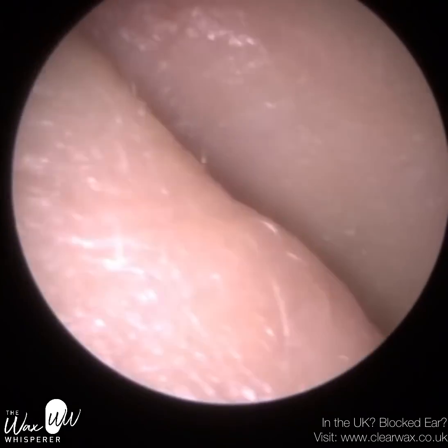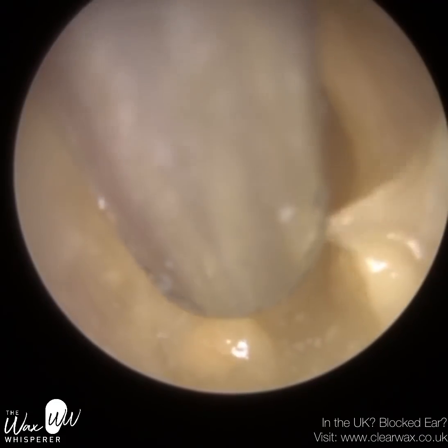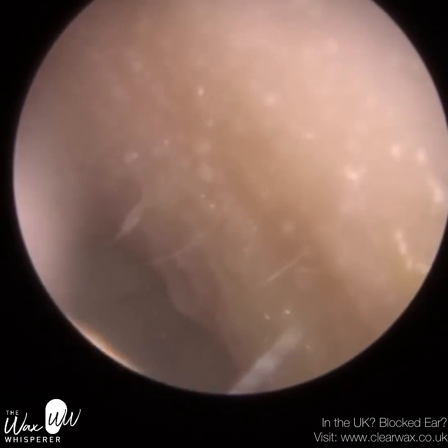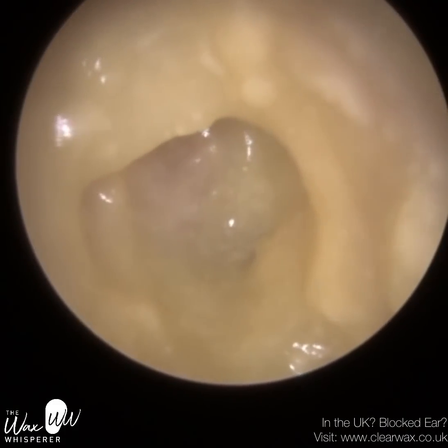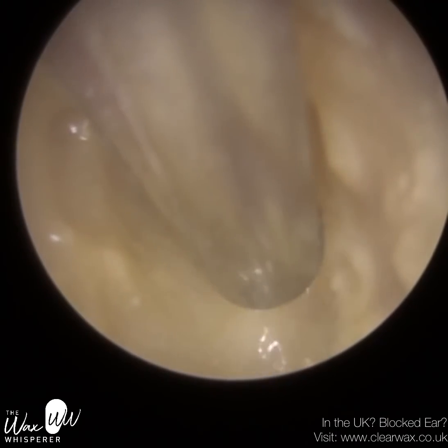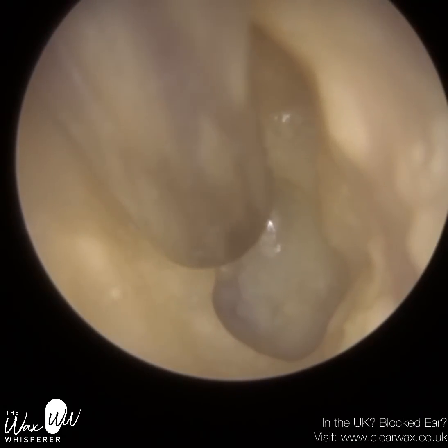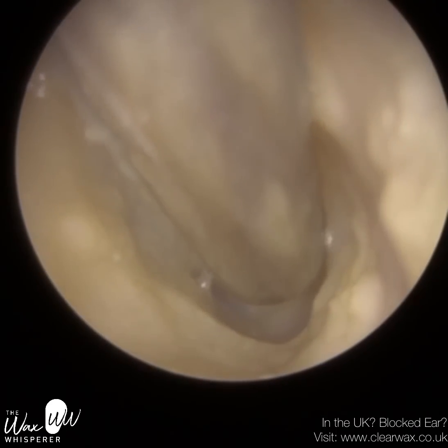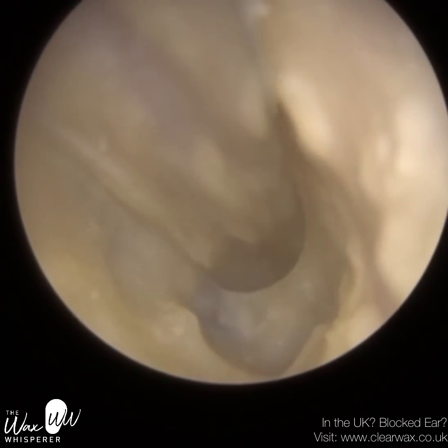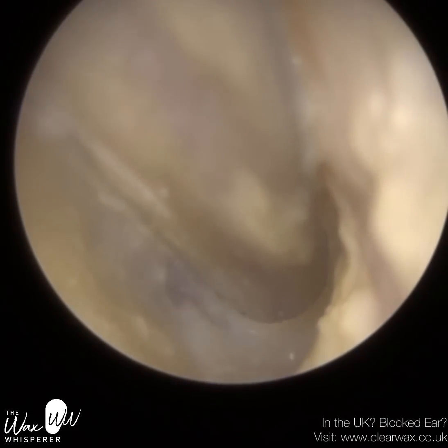They are a hearing aid wearer as well, and if you are prone to having ear infections, sometimes a hearing aid can exacerbate the infections, and that's because this patient wears a hearing aid with a mold piece, an ear mold, and although it's got a ventilation hole running through, it's quite a small ventilation hole, and that is in part because of their hearing loss. They've got quite a severe hearing loss, and if you have too big a ventilation hole, not only does a lot of the sound that's being amplified in the ear escape back out of the ear through that ventilation hole, but it can also lead to acoustic feedback, so whistling of the hearing aid. And that's audible to not only the patient sometimes, but also those around them.